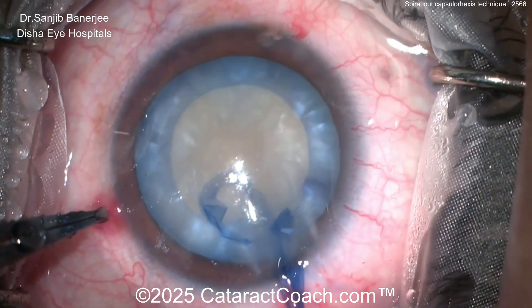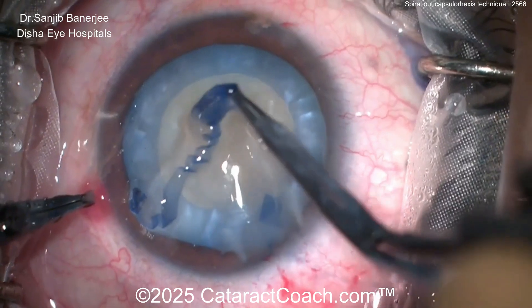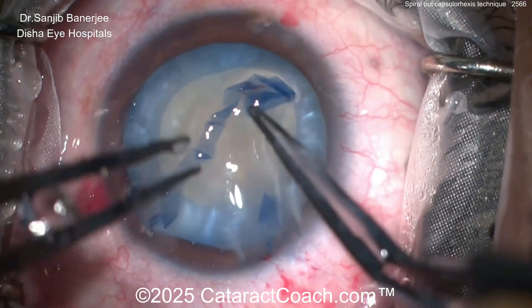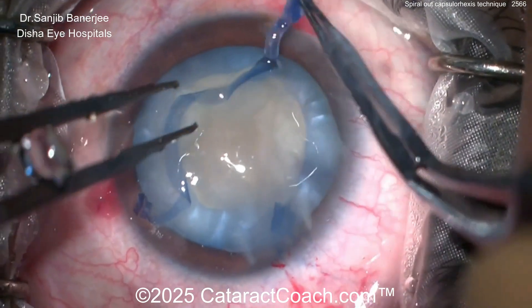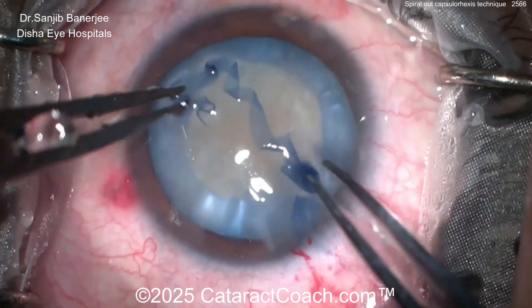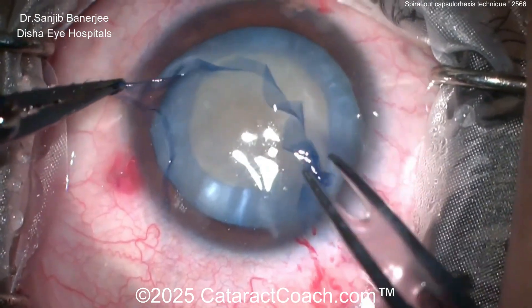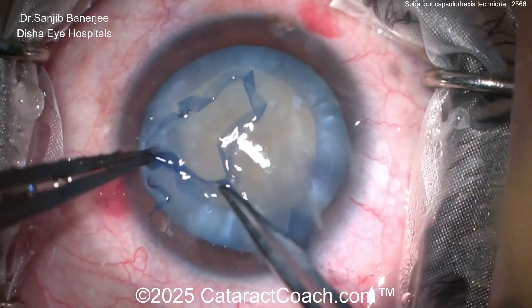Look at that — that's a perfect-looking rhexis. And look at the capsule as it comes out of the eye — it's so interesting, it's this long strip, because it was done with the spiral technique. Very interesting, so neat. Lots of ways to do these white cataracts — we've talked about almost all of them — and this is a nice technique because of the safety involved. Look at that long strip — wow.